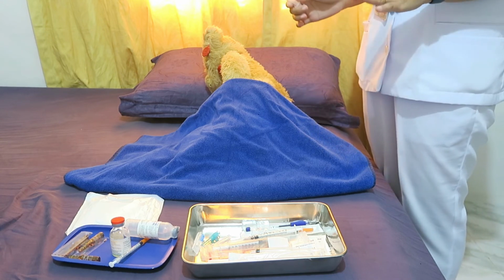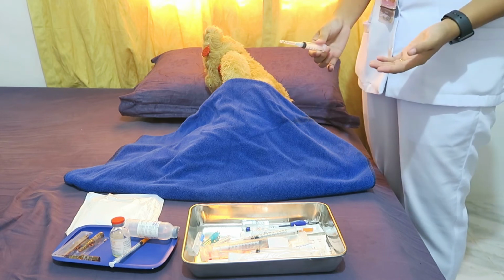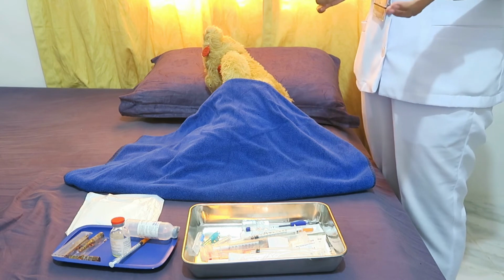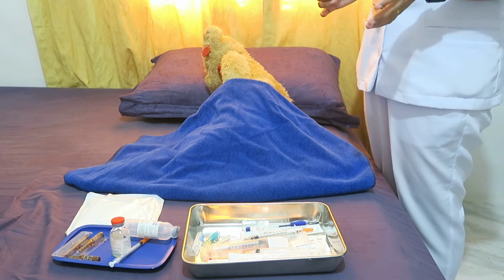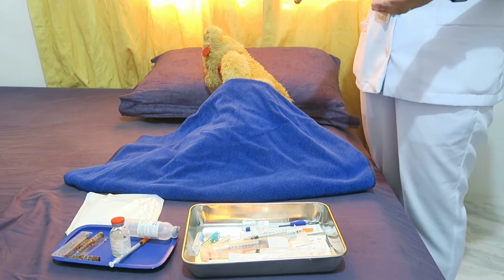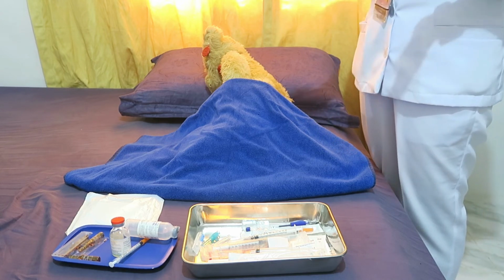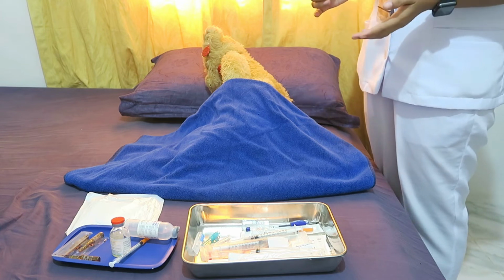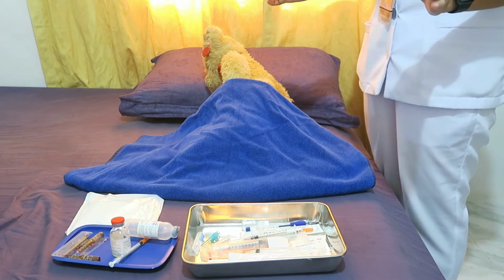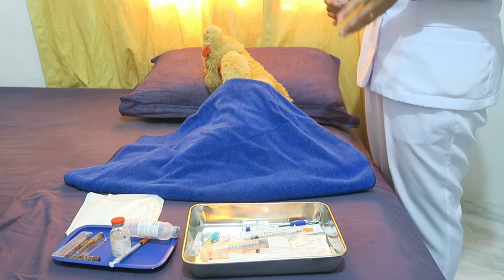So, next is holding the syringe between the thumb and the forefinger, as if holding a dart or pen. Pierce the skin quickly and smoothly at a 90-degree angle. The rationale for that is to obtain all the medication while keeping the needle sterile and to ensure insertion of the needle into the muscle.